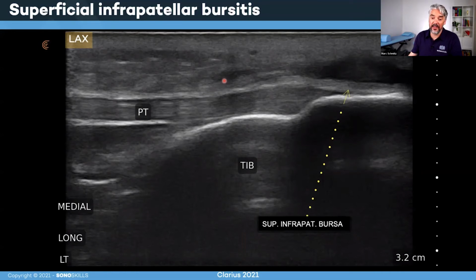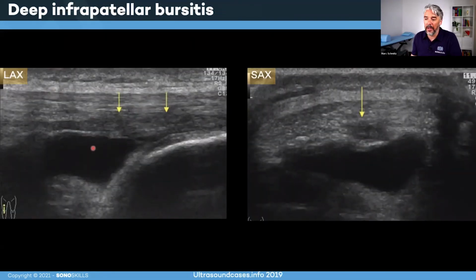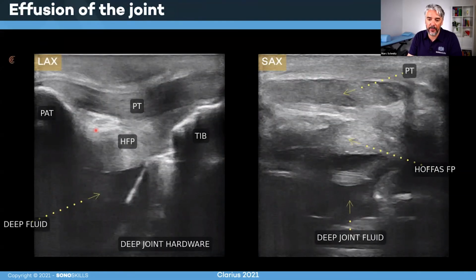I mentioned indeed the effusions around the patellar tendon. This is a superficial bursitis, infrapatellar bursitis, the superficial one on top of the tendon. This fluid you should never see, because if you see it, it's pathology. But in the deep portion, you will see some fluid in a physiological state. But in this case, it's too much fluid. It's way too big, actually. So that's the reason why we say that this is a deep infrapatellar bursitis.